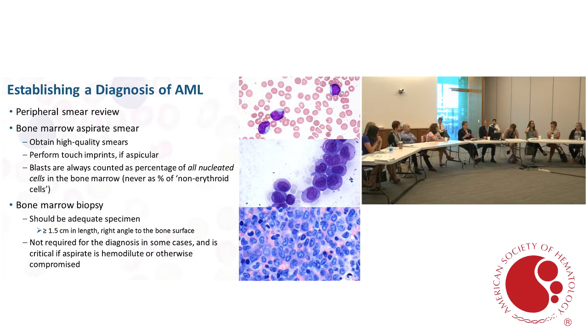The other thing you could do with the core is they can be disaggregated. They can be disaggregated for flow. They can be disaggregated for culture as well.